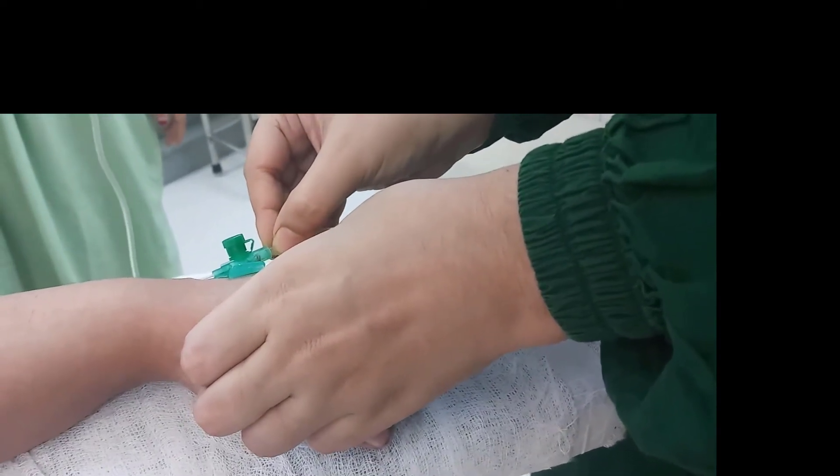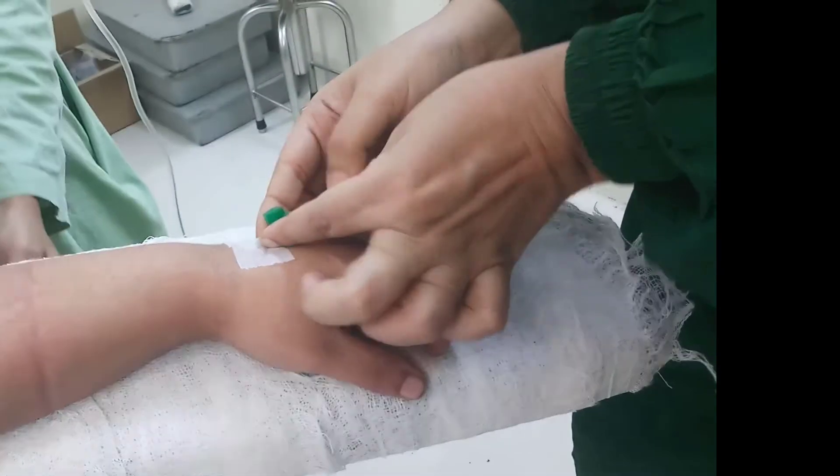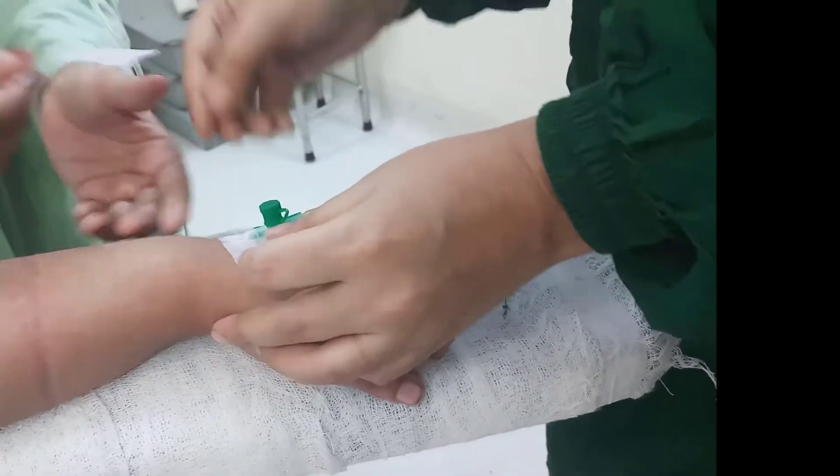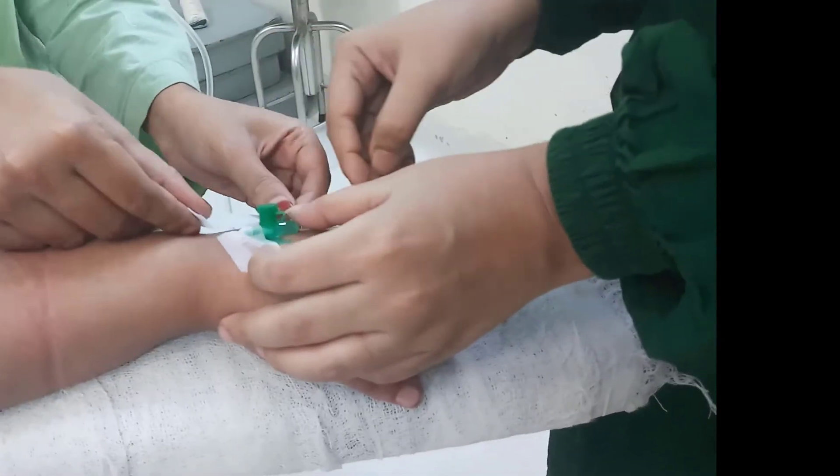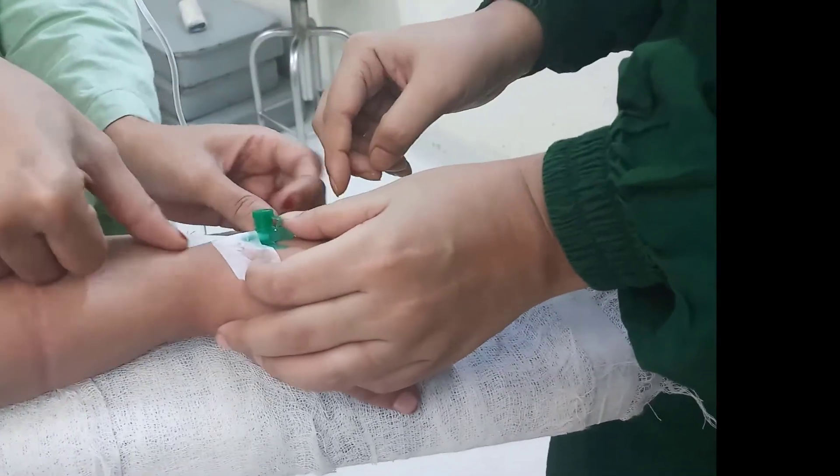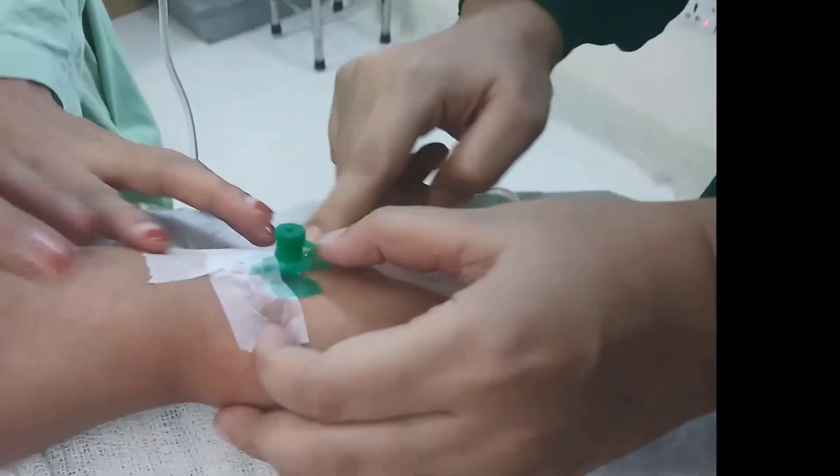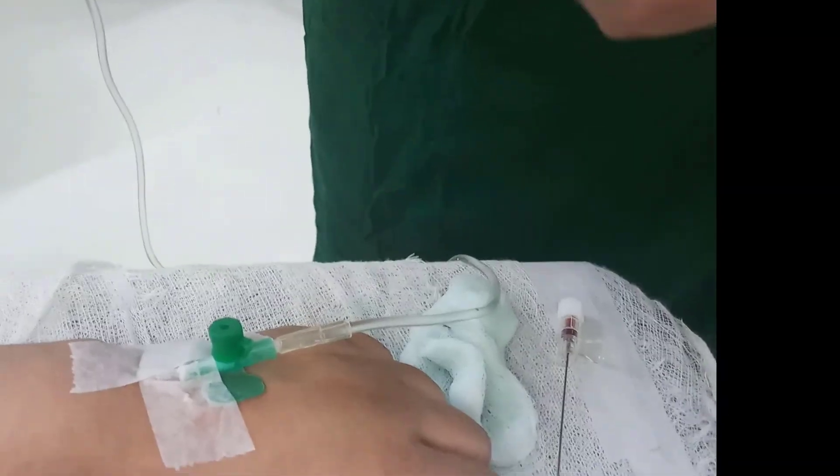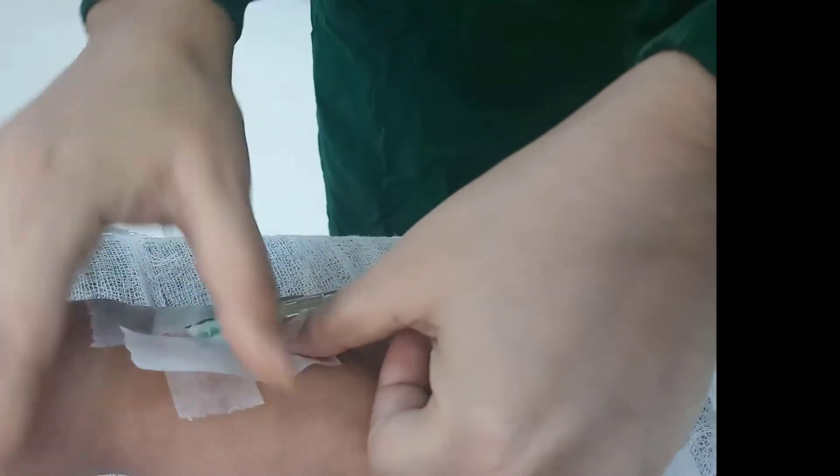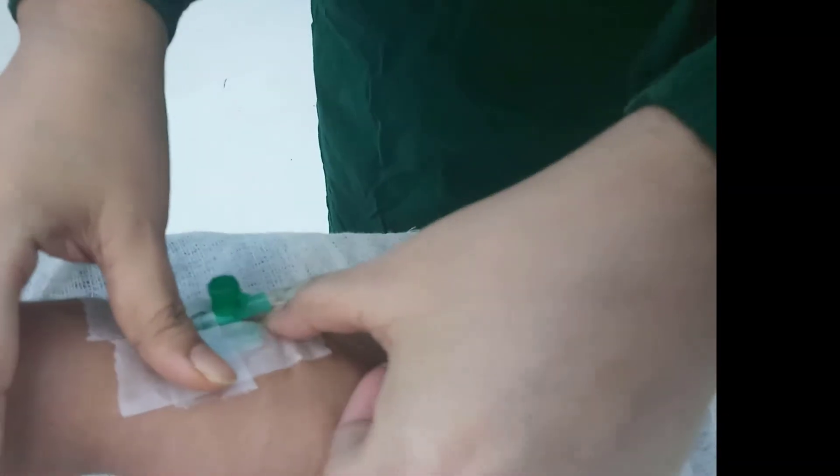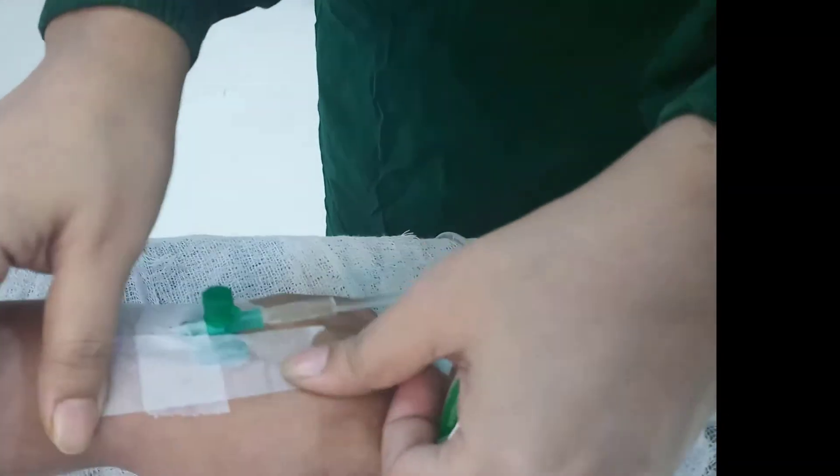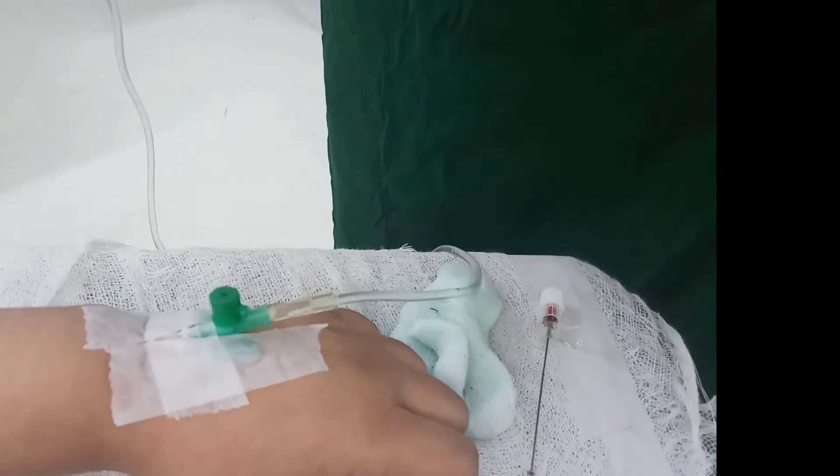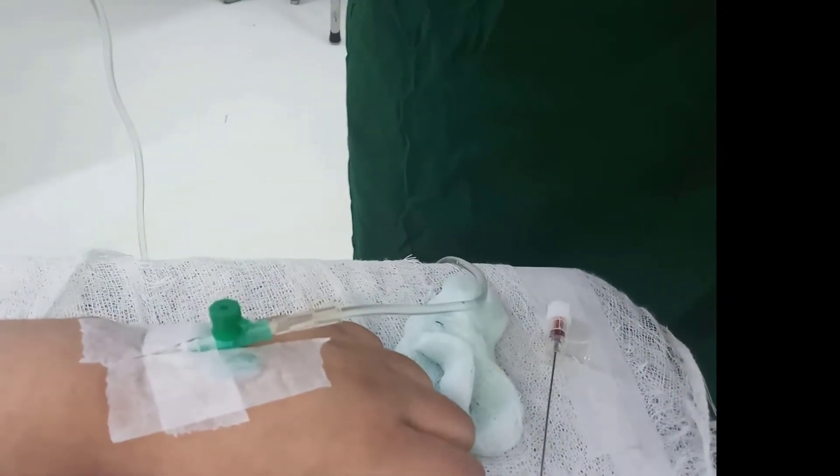The cannula is then fixed by micropore. The date and time of placement of the cannula should be documented.